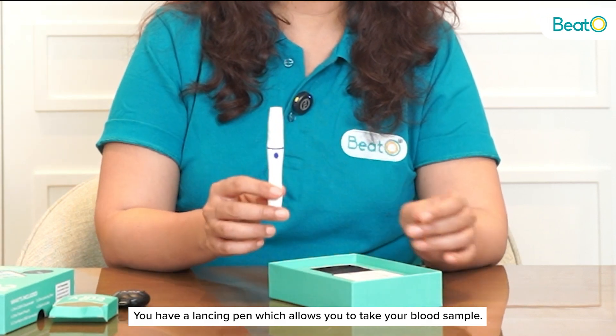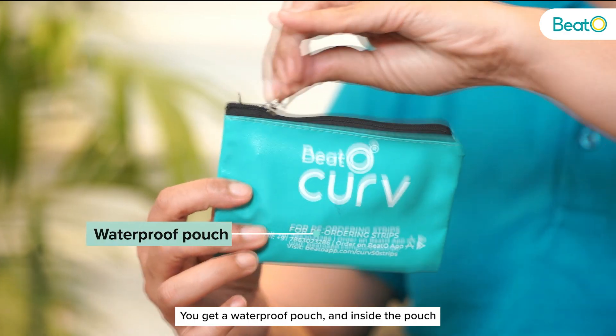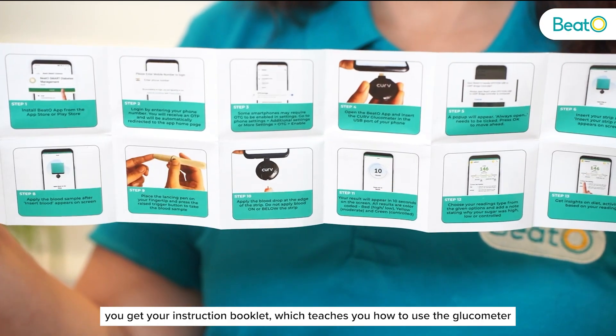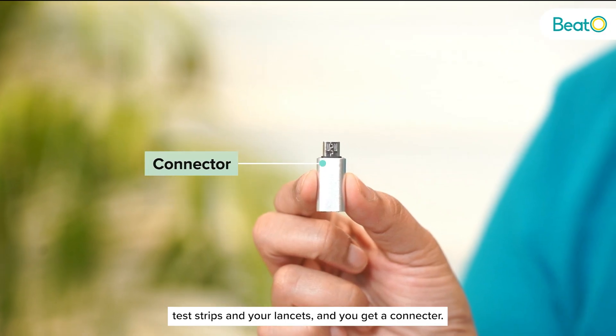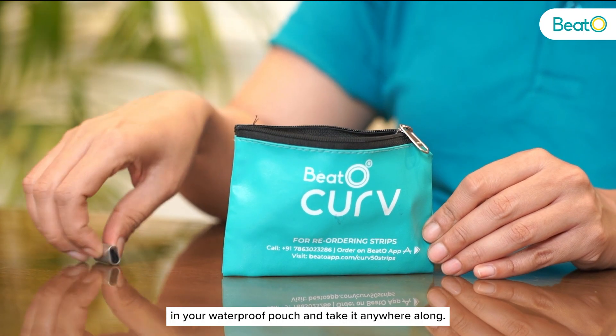You have a lancing pen which allows you to take your blood sample. You get a waterproof pouch and inside the pouch you get your instruction booklet which teaches you how to use the glucometer, test strips and your lancets. And you get a connector. You can easily carry your kit in your waterproof pouch and take it anywhere.